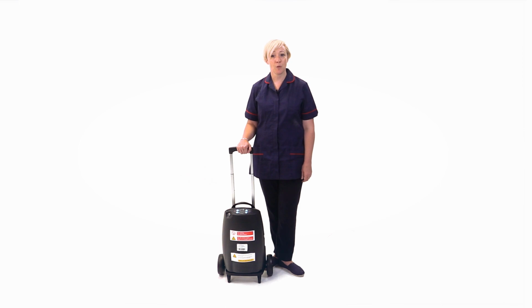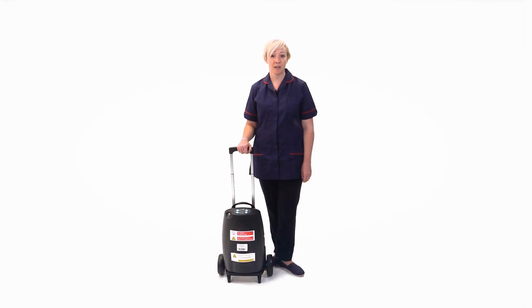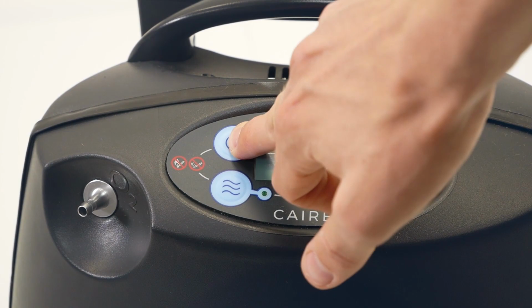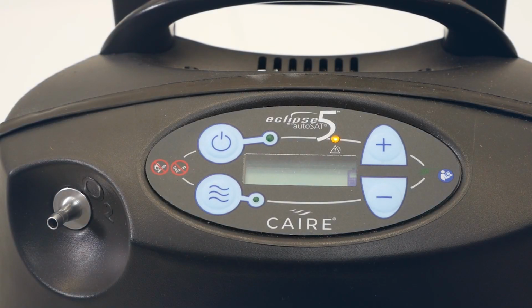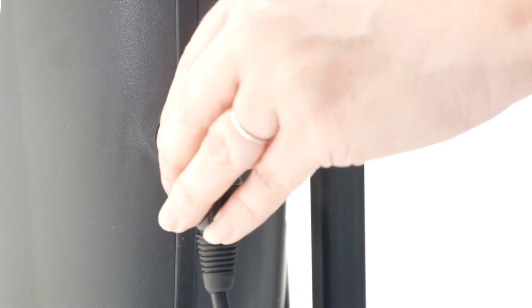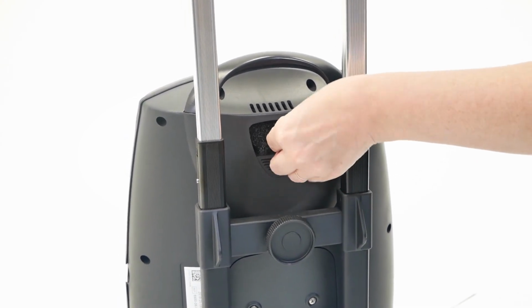The representative from your home oxygen service provider will have set up the concentrator as per your home oxygen prescription and will leave it ready for you to use. It is important that you do not alter the flow rate unless you have been instructed to do so by your healthcare professional. The main parts of the device that you need to be aware of are the telescopic handle, the power button, the control panel, the oxygen outlet, the power input, which connects either to AC or DC power supply, the air inlet filter, and the exhaust vent.